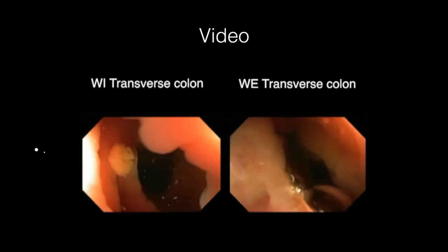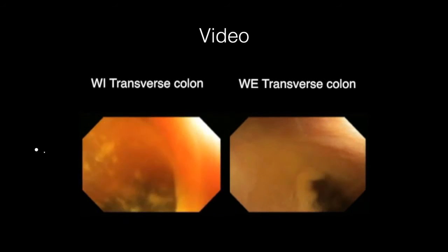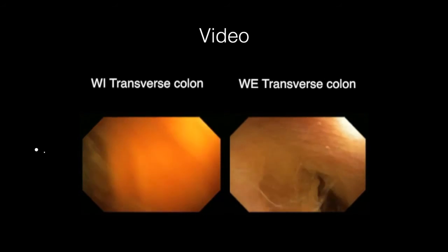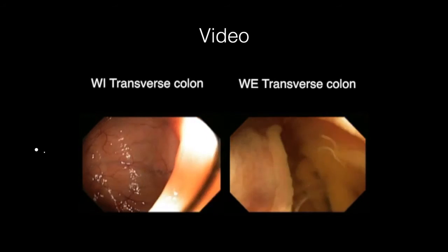In water exchange, the suction port is kept in the middle of the lumen to avoid capturing of mucosa. If there is capturing of mucosa, slightly withdrawing the instrument helps release the mucosa from the suction channel port.